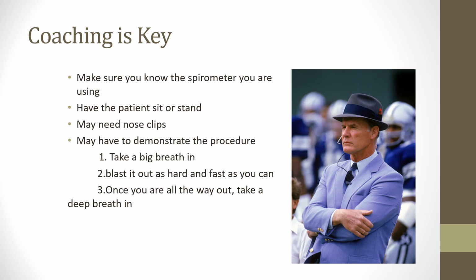You might need to use nose clips, and I showed that in the other video, right? Those little nose clips that go over the nose. That's a big thing because it can allow for gas to escape through the nose. So they recommend using nose clips for almost every pulmonary function test we do.